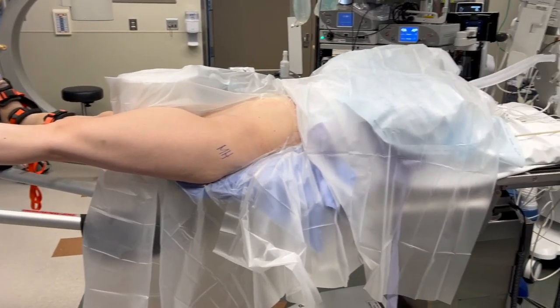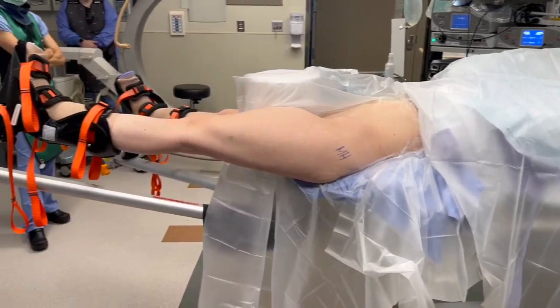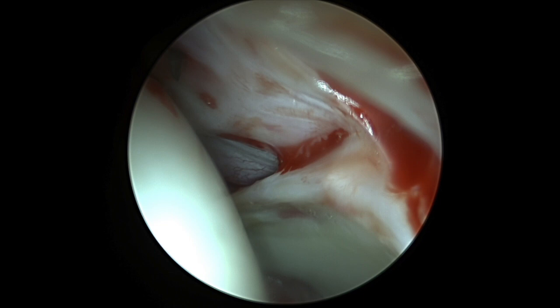The patient is positioned supine on a lower extremity suspension table with a perineal post and the feet placed into padded boots. Following creation of standard anterolateral and mid-anterior portals, an interportal capsulotomy is made in the standard fashion. A diagnostic arthroscopy should then be performed.